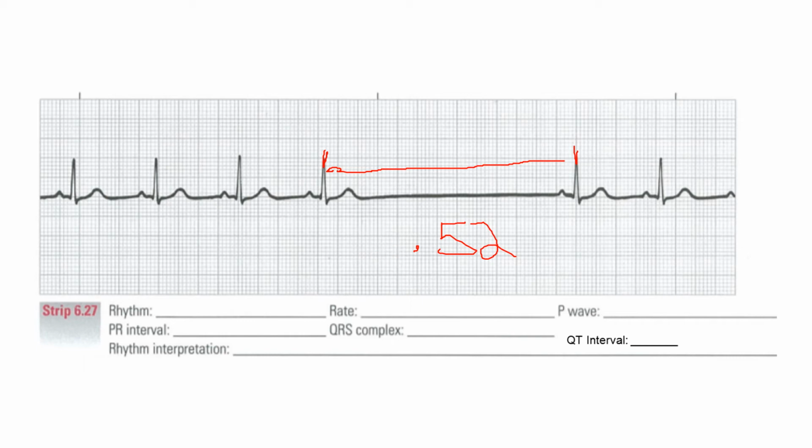And again, you always want to check your patient, make sure that they're okay, and see if they're having lots of pauses or frequent pauses. That would be something that would be significant.